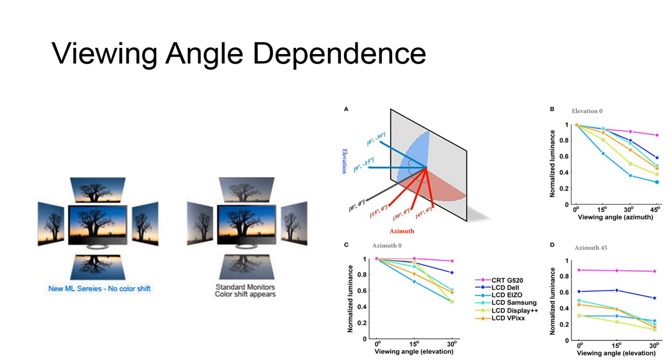Viewing angle dependence is often referred to in similar terms when you're looking for a flat screen TV or a new computer monitor. Various manufacturers create screens that have pixels set at various angles from perpendicular, but may need to have their brightness adjusted. An objective comparison can be made by positioning a photometer at increasing angles from perpendicular, maintaining a precise distance of 1 meter from the center of the screen. Percentage of luminance can be determined and validly compared to those obtained from other manufacturers.